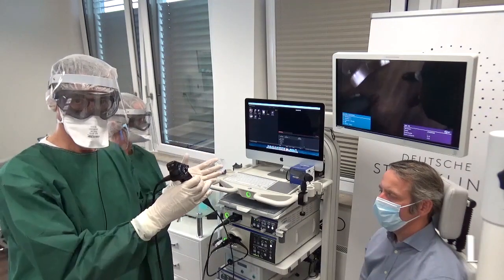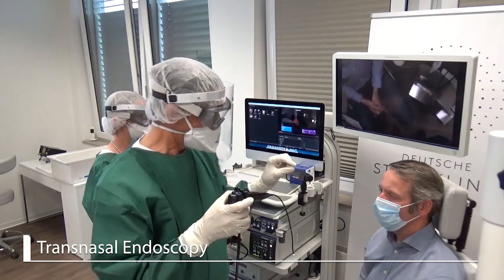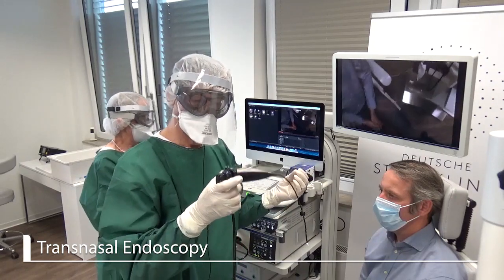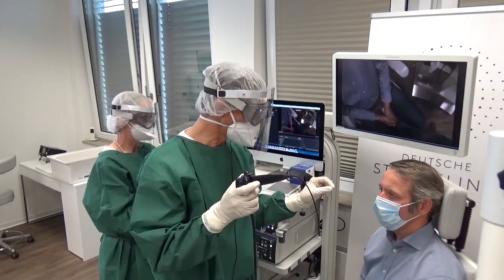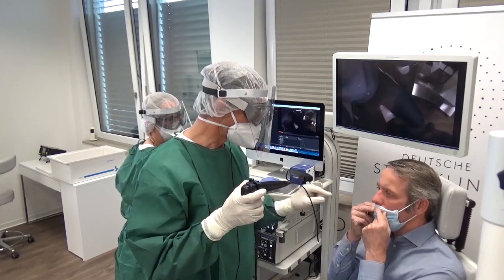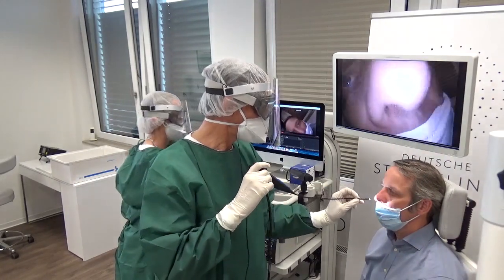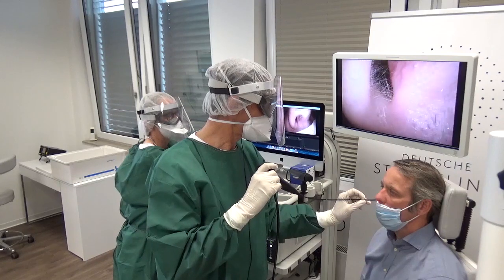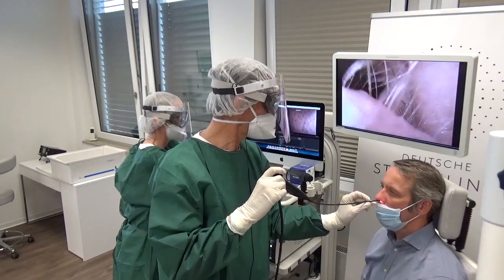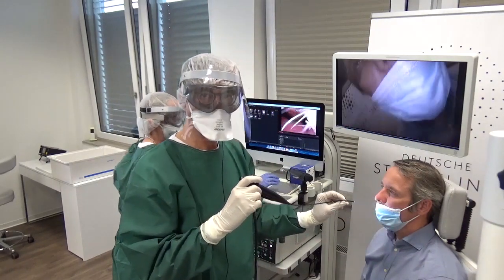We are all not contaminated, so up to now this is a clean situation. But in a second I will contaminate my left hand again, keeping the right hand as clean as possible. I ask the patient to please put down the mask and cover the mouth. Then I will have a look on one side, have a look on the other side, decide which one I would prefer, and then do the procedure.